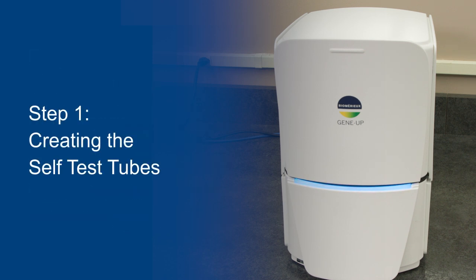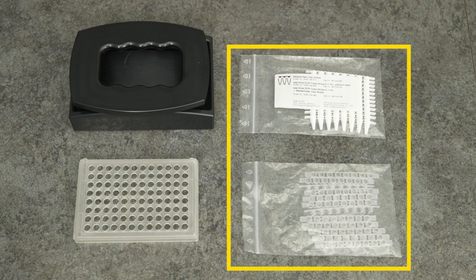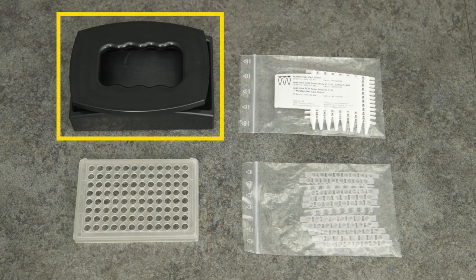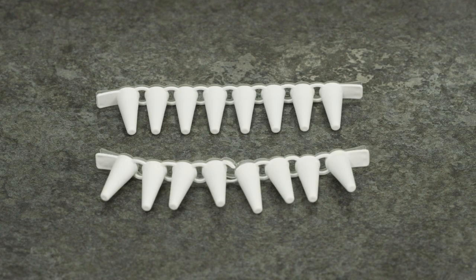Step 1. Creating the self-test tubes. To create a new set of self-test tubes, you will need the following items: Eppendorf tubes with their clear optical caps, GeneUp PCR tube holder, GeneUp lysis tube remover and capper. The self-test tubes can be reused repeatedly until there are physical signs of deterioration.